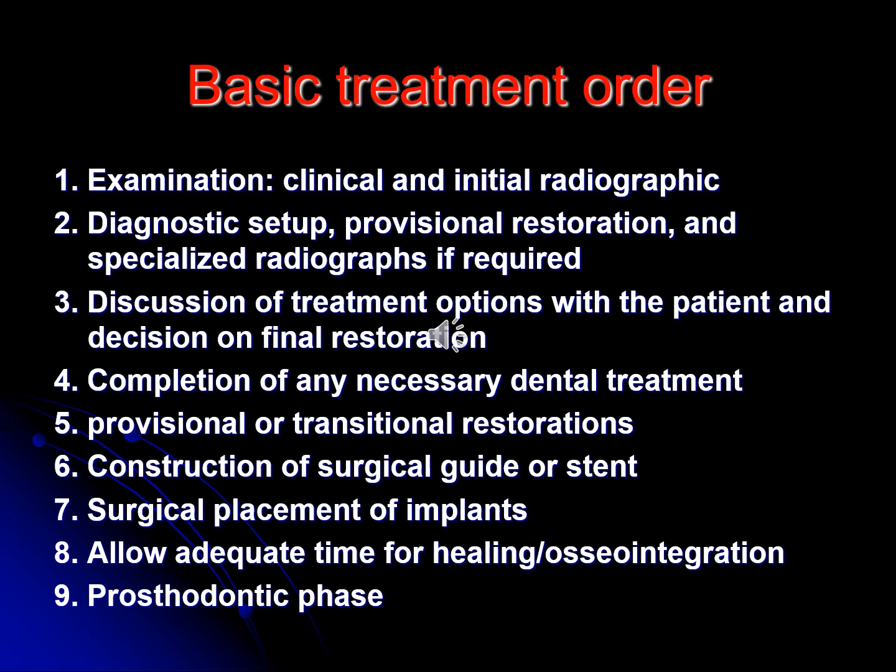I will give you a summary about our steps to prepare an ideal treatment plan for implant restoration. When a patient visits us for implant placement, we will take the following steps with him. First of all, the examination, clinical and initial radiograph, is very important. Second, we will take impression for the patient and prepare mounted study cast and diagnostic wax-up. Start from the end, design the prosthesis first.